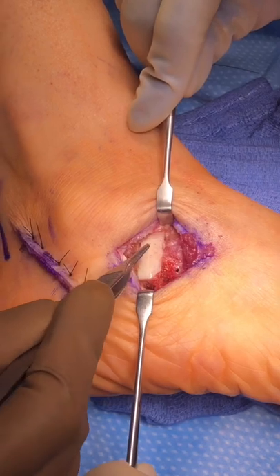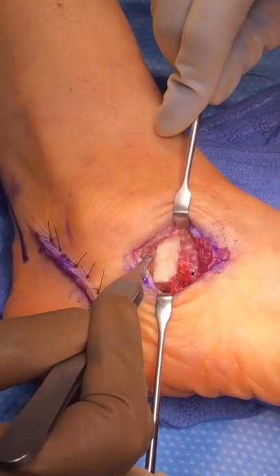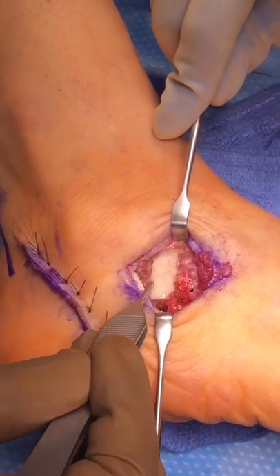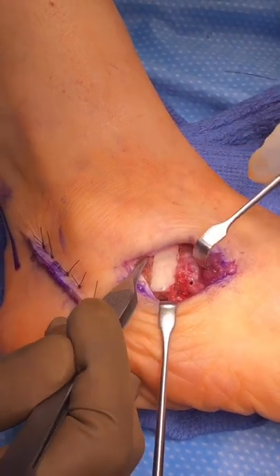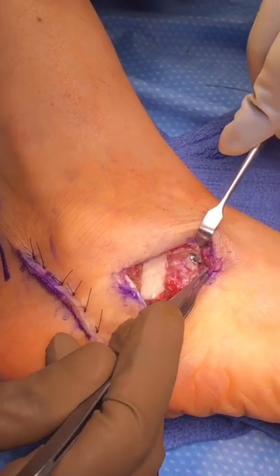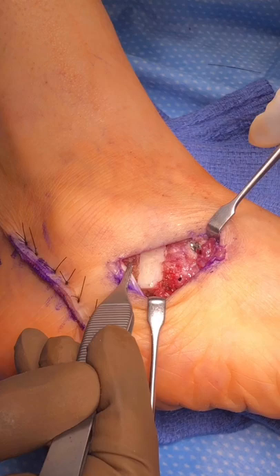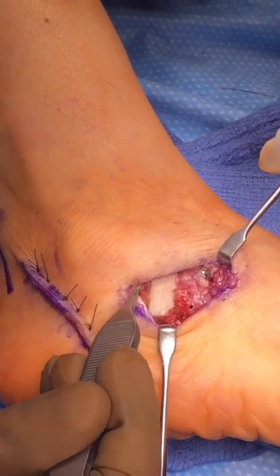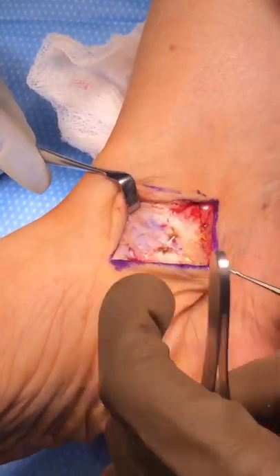After cutting the bone at the anterior process, you can see we put this pre-shaped block of bone in here to lengthen the bone — we call that a lateral column lengthening. Here you can see the one screw we've placed to hold that block of bone in there and allow it to heal to the heel bone.